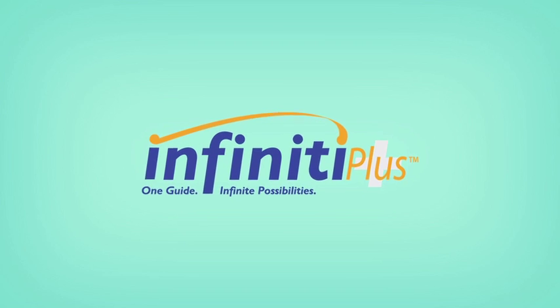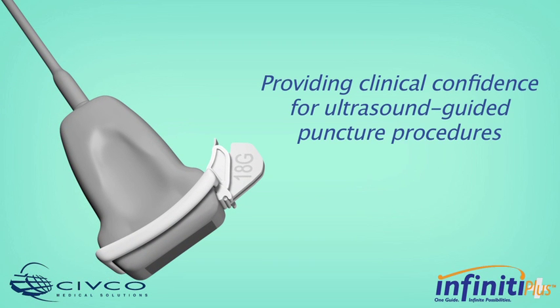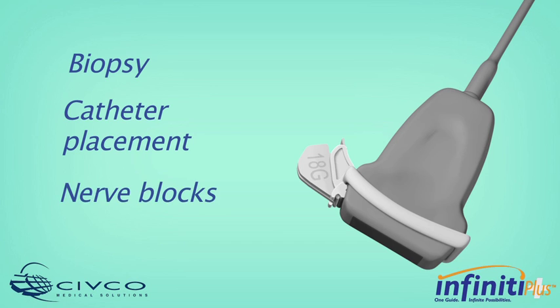Reliable in-plane positioning. It's made possible through CIVCO's innovative Infinity Plus Needle Guidance System, offering infinite angle capabilities and providing clinical confidence for ultrasound guided puncture procedures, including biopsy, catheter placement, and nerve blocks.